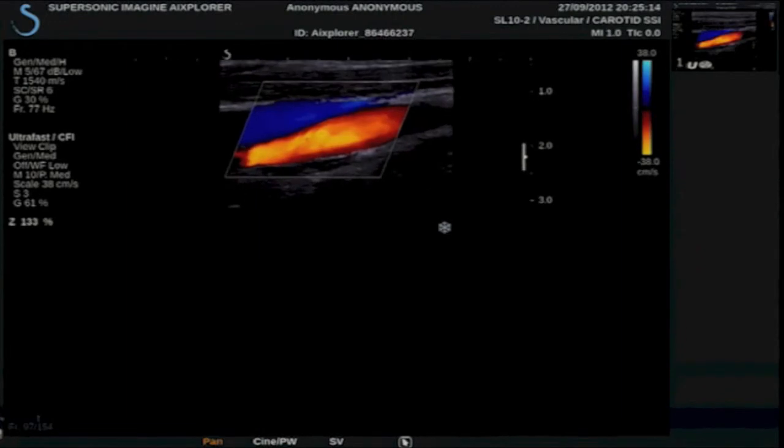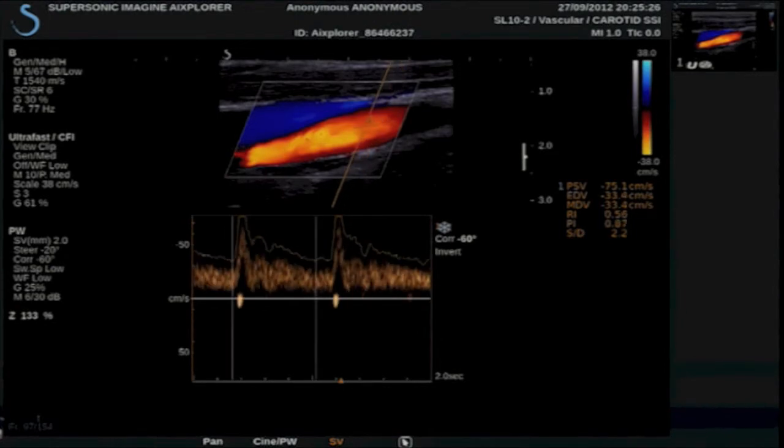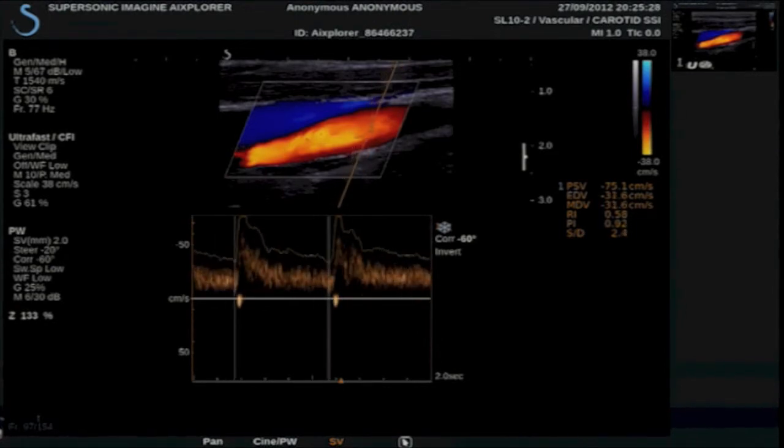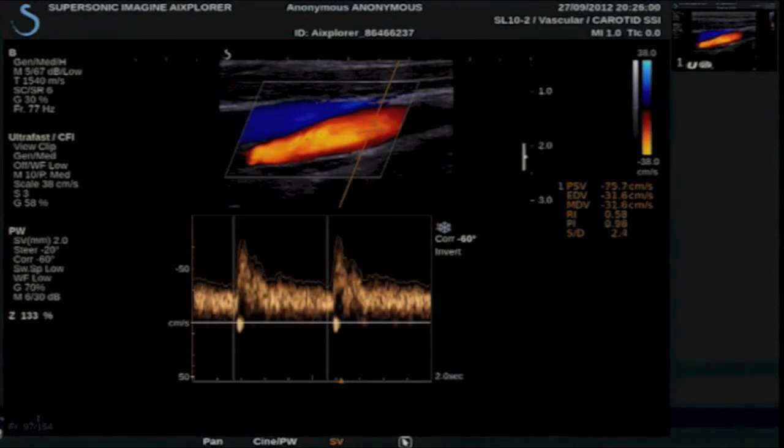I am going to zoom on my image. I can now add my spectrograms and place my sample volume wherever I want. Notice the flow profile is changing as I move across the vessel — I am retrospectively quantifying the flow information I acquired using the ultra-fast Doppler. I could do an angle correct if necessary, change my sample size, shift the baseline, change my gain and scale. I have selected the autotrace — the pulse wave autotrace — which will automatically calculate my peak and end diastole measurements, and also give us a resistive index and a pulsatility index.